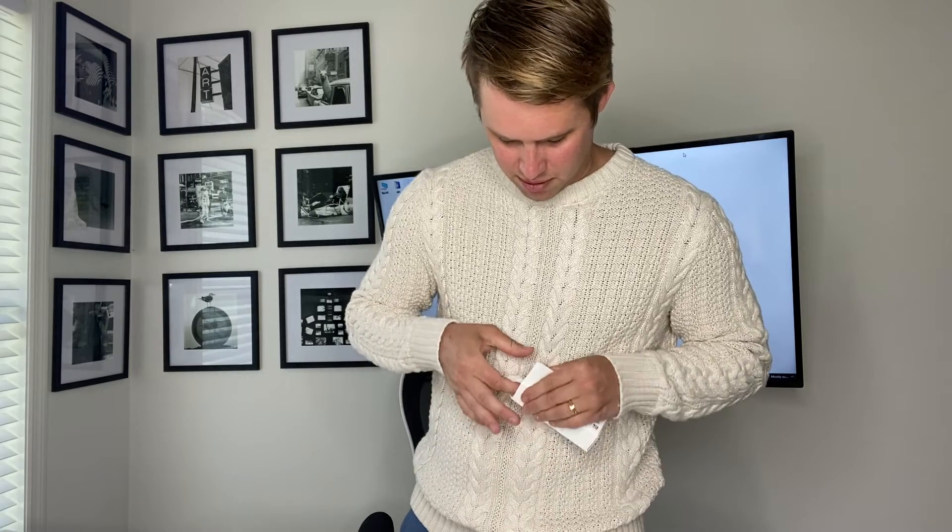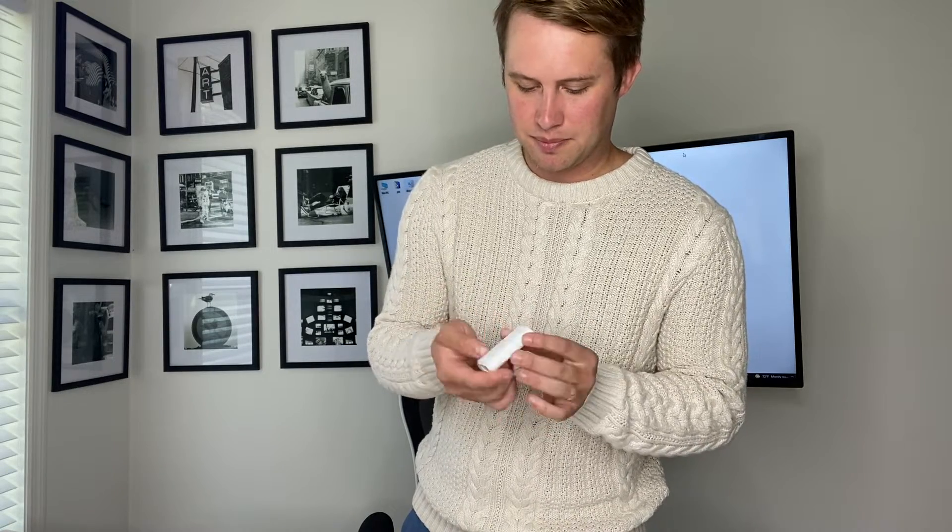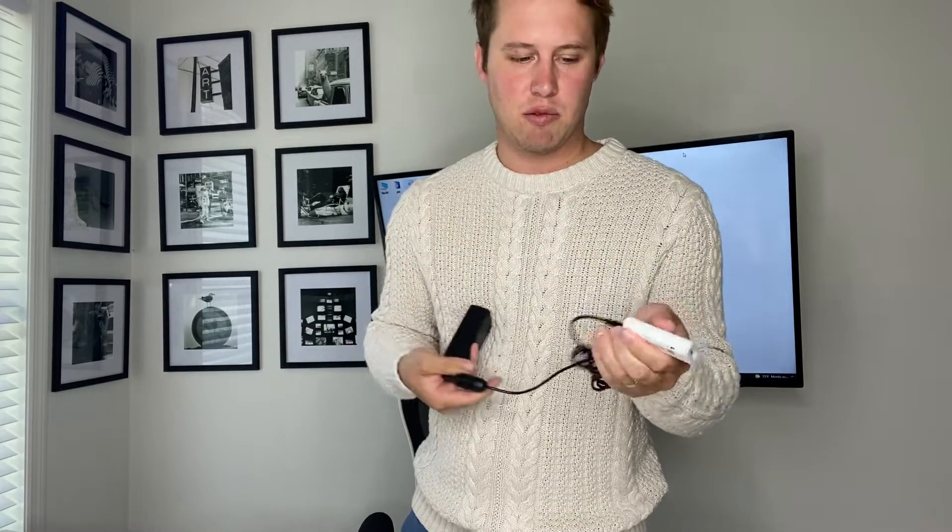It looks like we have a new accessory here - the adapter, or USB-C adapter box. The power cable will go in here, and a USB-C connection will run from the scanner as well as another power source. We also have our model so we can practice scanning.